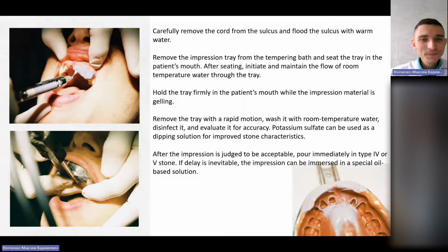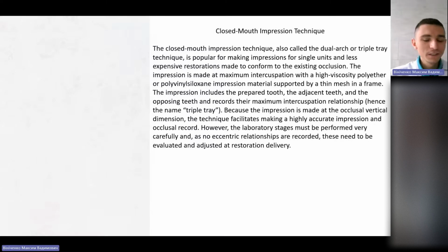So let's understand it's a very difficult procedure. Maybe that's why we use silicone or alginate. But Americans like these materials.